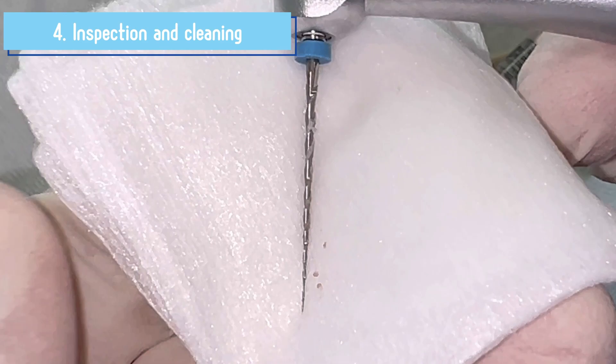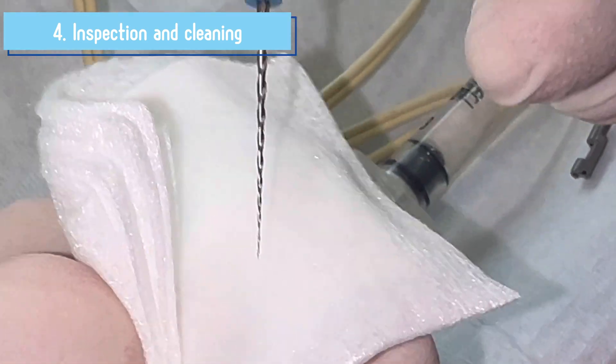After each use it is important to check the files and clean the dentin debris to avoid a cyclic fracture.